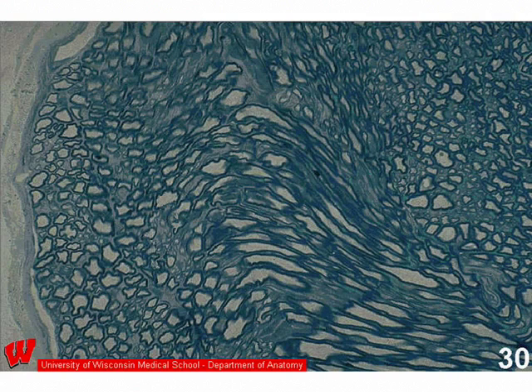And the next micrograph, which is at low magnification, it's very difficult to see any sort of cellular detail here, but you see all of these darkly stained structures with pale centers, and they're cut in various planes of section. So over here, they're cut in transverse or cross section, whereas just to the right, they're cut in more longitudinal section, and in other places, they're cut sort of halfway in between, what we would call an oblique section.